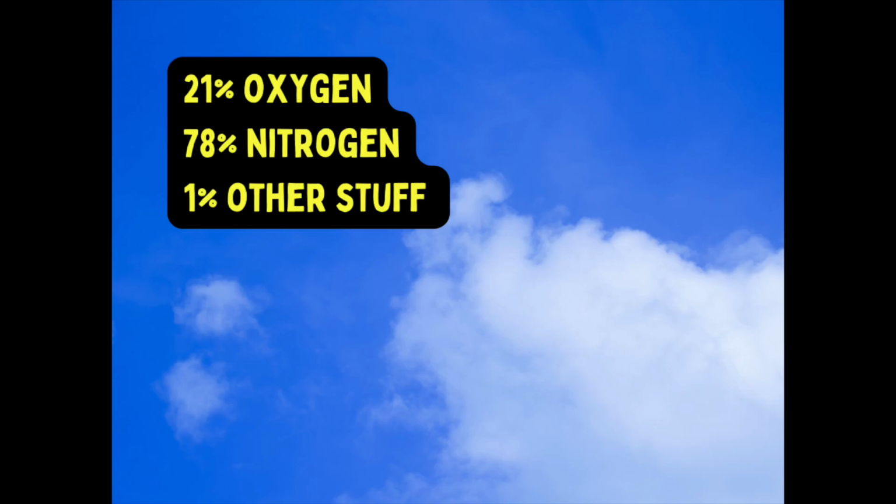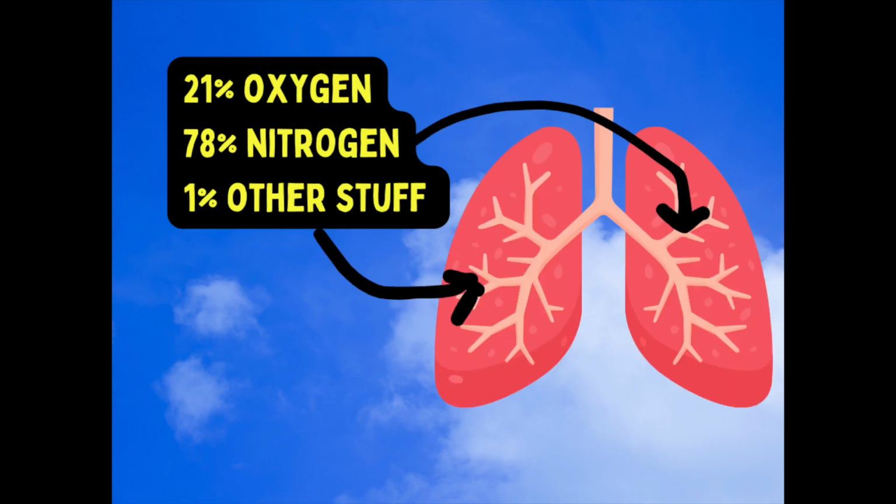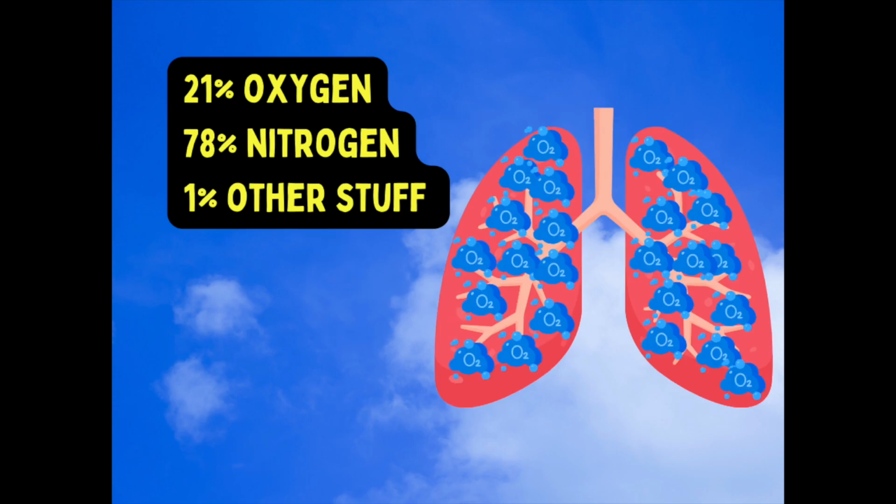You're striving to achieve nitrogen washout. The ambient air has 21% oxygen, 78% nitrogen, and 1% other gases like argon and some other stuff. That means that inside the patient's lungs is going to only be 21% oxygen. You want to wash away all that 78% nitrogen and replace it with oxygen molecules. When you do this, in theory, you have more time to perform laryngoscopy. They say that it will give you up to 5 minutes of safe apneic time to use your laryngoscope and find the glottis and place the tube.